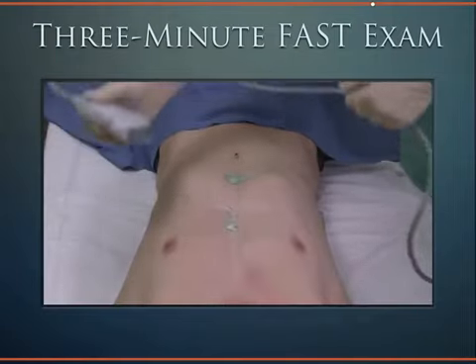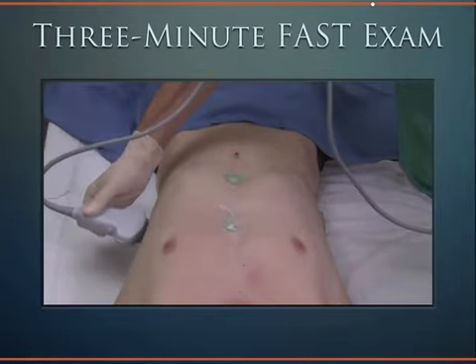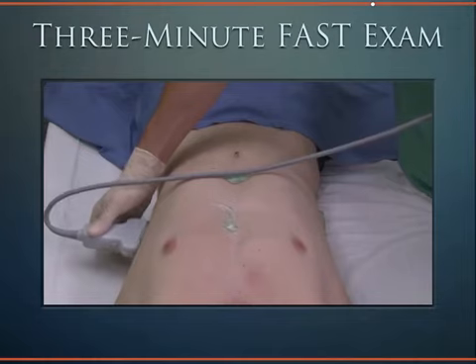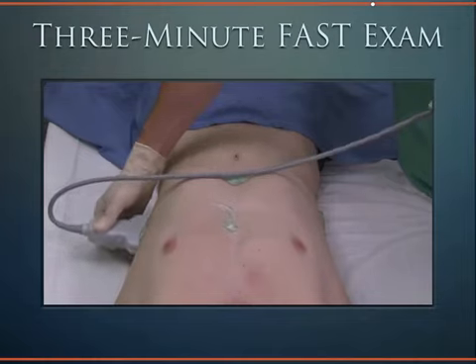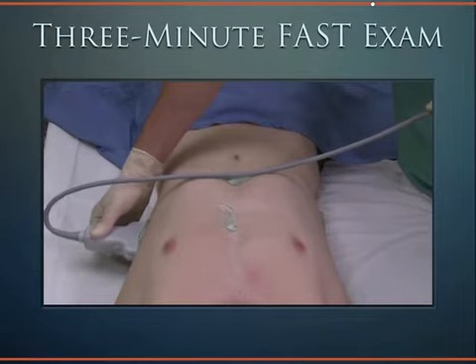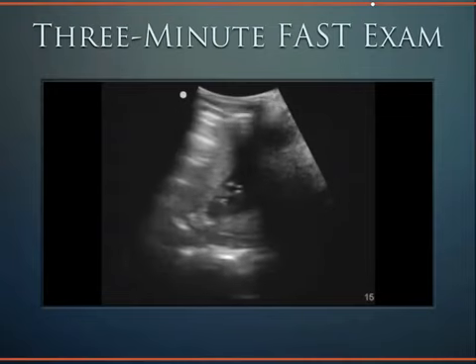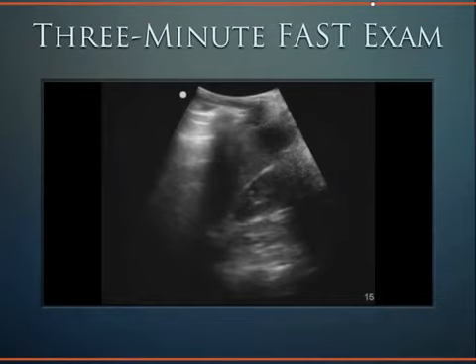The next window of the FAST exam involves the splenorenal view. With the indicator towards the patient's head, position the transducer over the 10th intercostal space. Then, with the indicator towards the head, mid-axillary, slide superiorly and inferiorly to get the entire contents of the splenorenal window into view and fan anteriorly and posteriorly to get the optimal window.